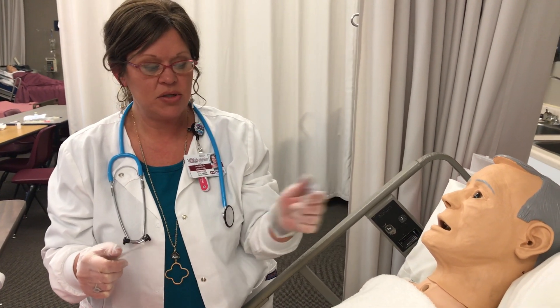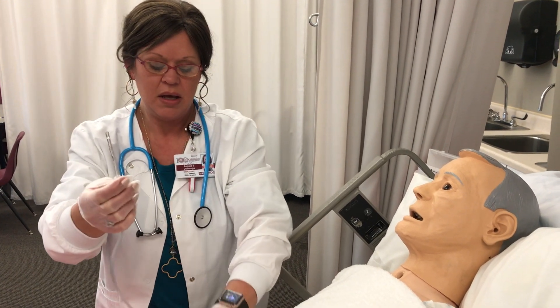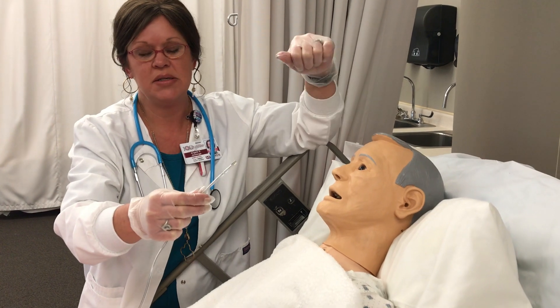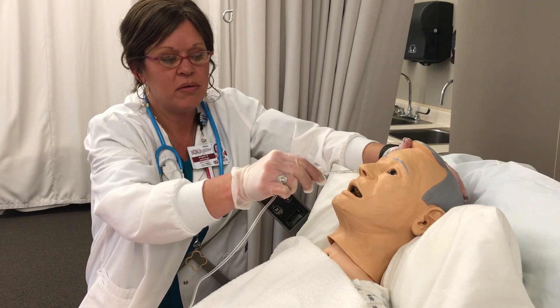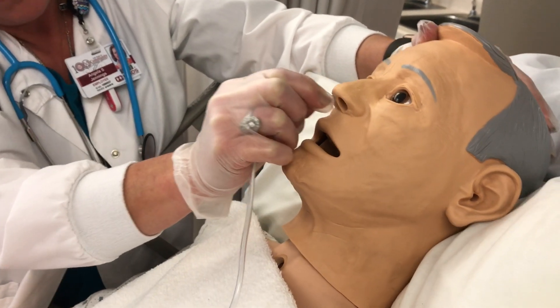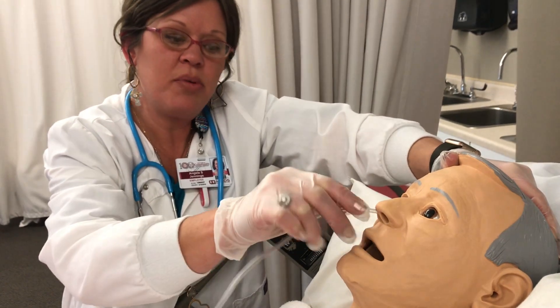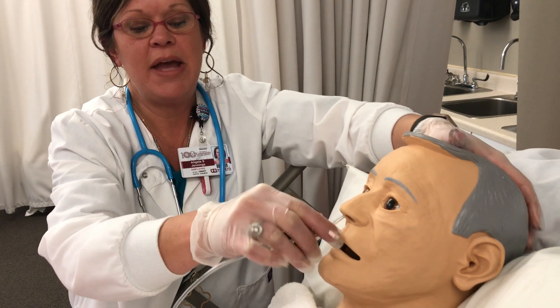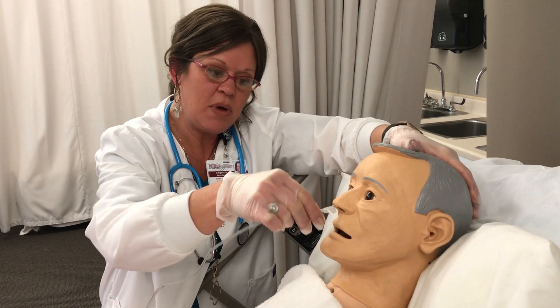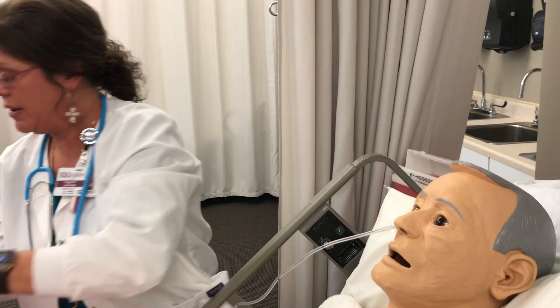Now we are ready to insert the tube. We're going to lubricate the tip. You can have your client get some ice chips, chew and swallow as you're doing this, because this is not a very comfortable procedure. We're going to tilt the head back and begin to insert. As soon as I get the gag reflex, I want the patient to tilt chin to chest, then tell them to swallow and keep pushing as fast as you can. Now we're all the way to where our marker is, so we should be where we need to be.